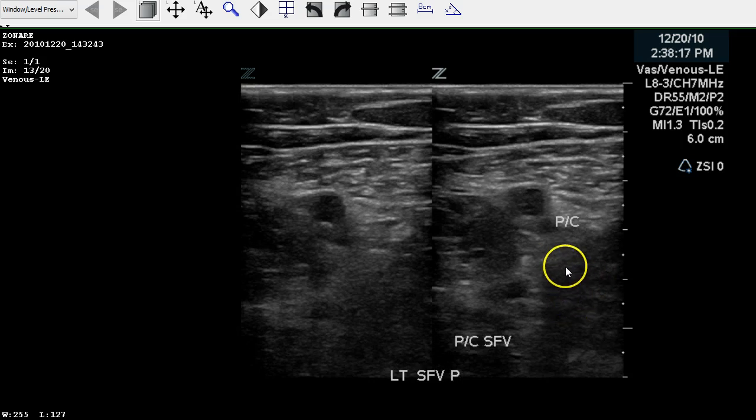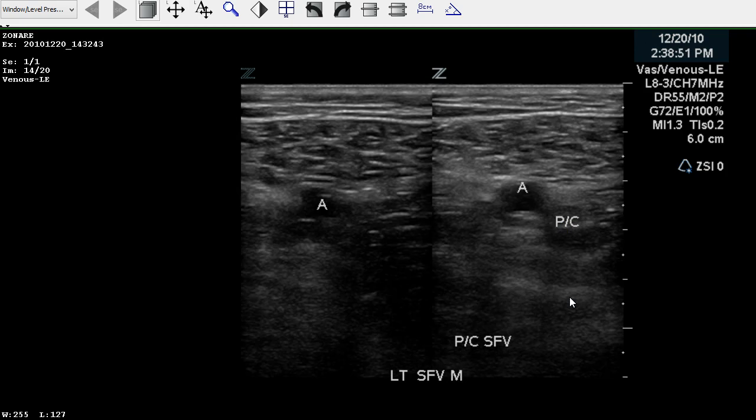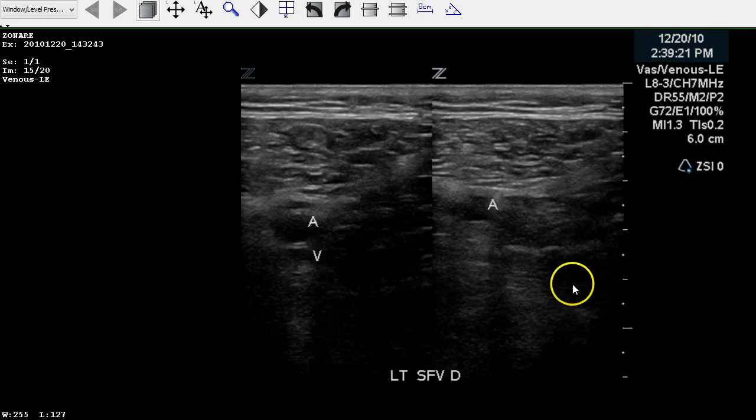We move further into the thigh and we see partial compressibility of the femoral vein at mid. The distal femoral vein appears to compress — you see the vein here directly beneath the artery and the compression picture. So there's a part of this vein that is fully compressible.